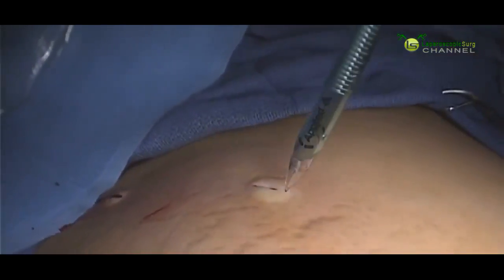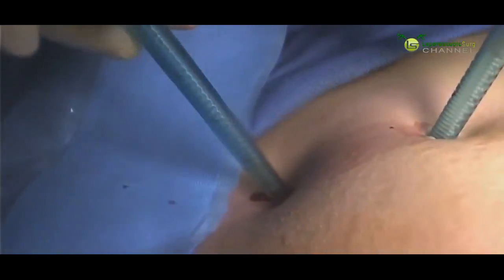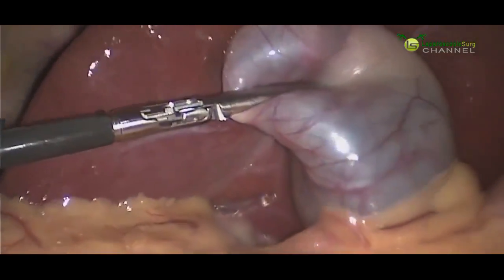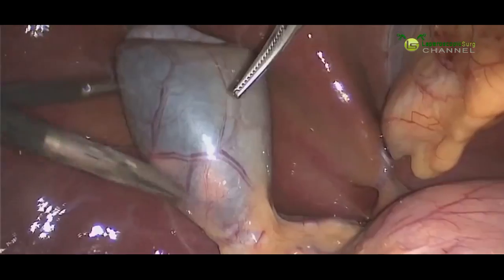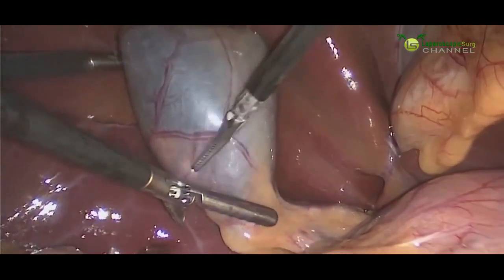We insert another trocar through the abdominal wall, a third, and our fourth and final trocar. These trocars allow us access into the abdomen so that we can place our instruments in and out to do the surgery. We grasp our gallbladder and retract it upward.